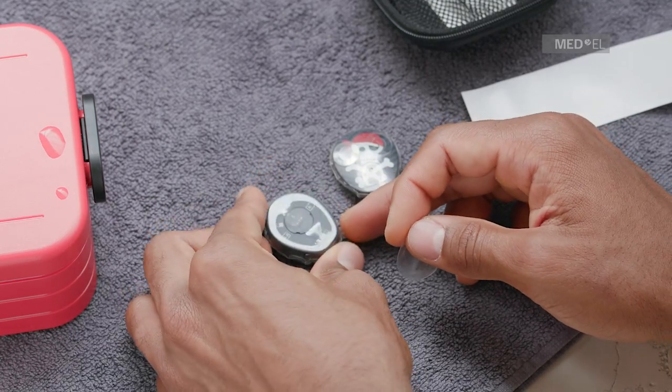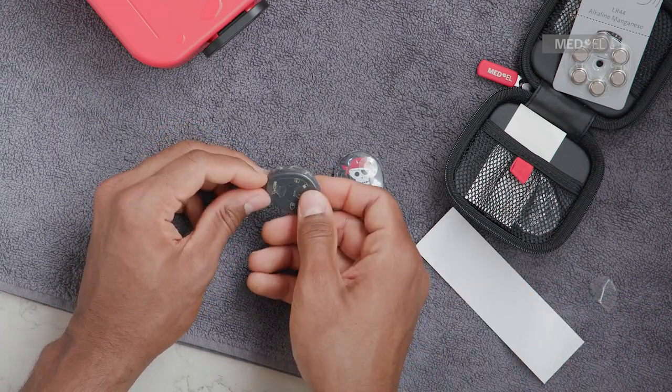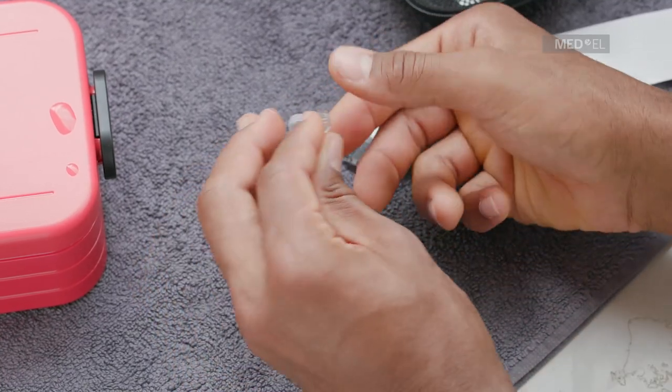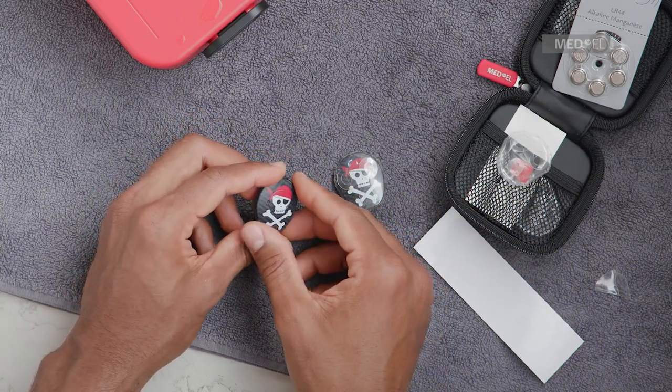Use the rectangular flap of the skin to gently pull Waterwear off Samba 2. Make sure that you do not damage Waterwear. Follow the previous instructions and ensure that the adhesive seal tape is correctly applied and that the Waterwear skin is not damaged before reusing it.